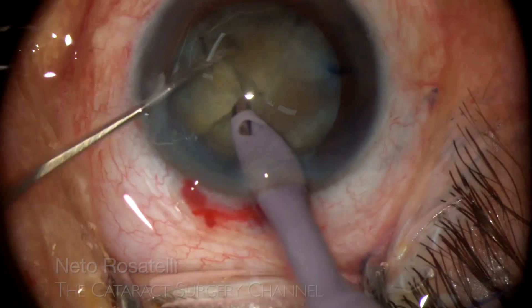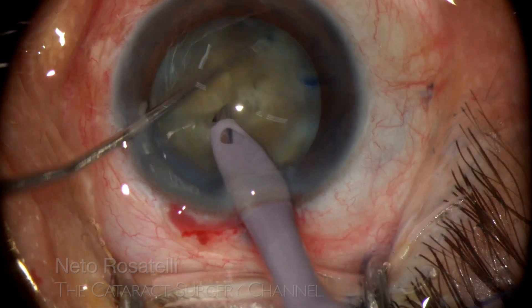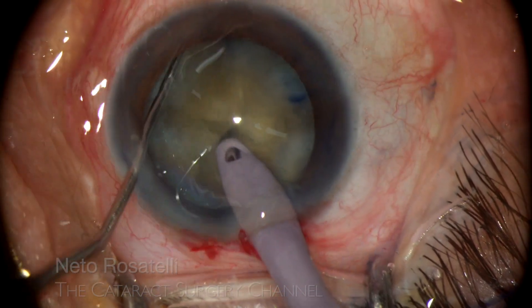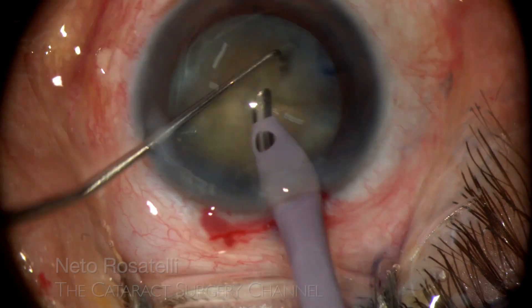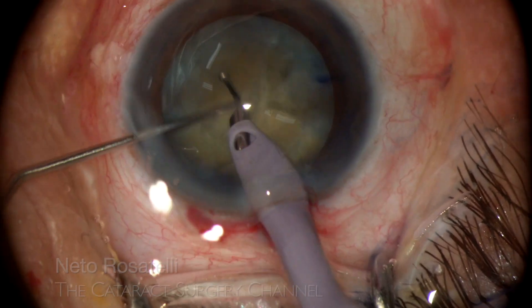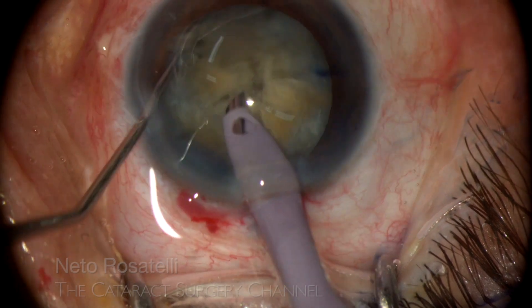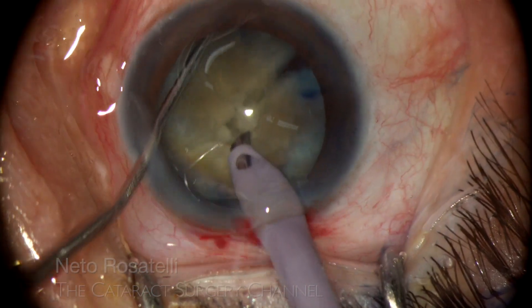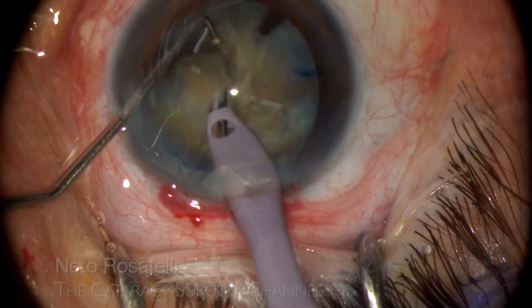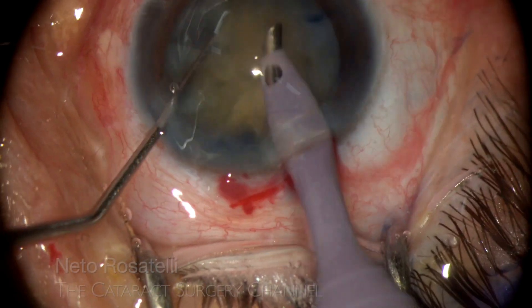It really helps to loosen the attached cortex, saving IA time ahead. Despite being a hard nucleus, I am able to mechanically fracture it in many pieces, saving phaco emission to be done only when emulsifying the pieces. I like to completely divide the nucleus first and then afterwards emulsify all the pieces. It is much more efficient and safer. The less you move, the better.